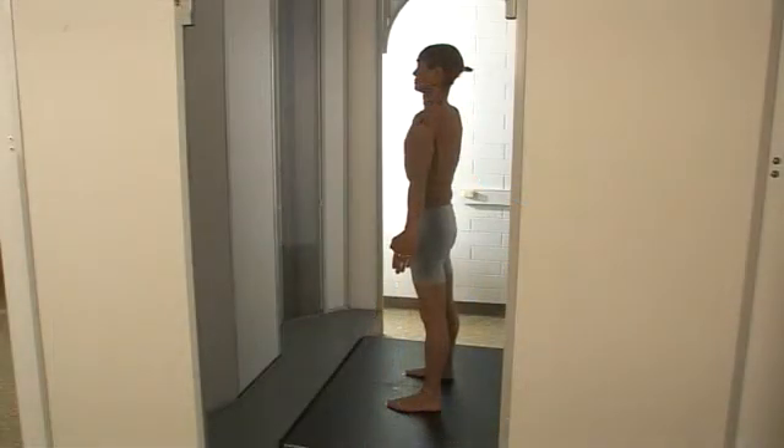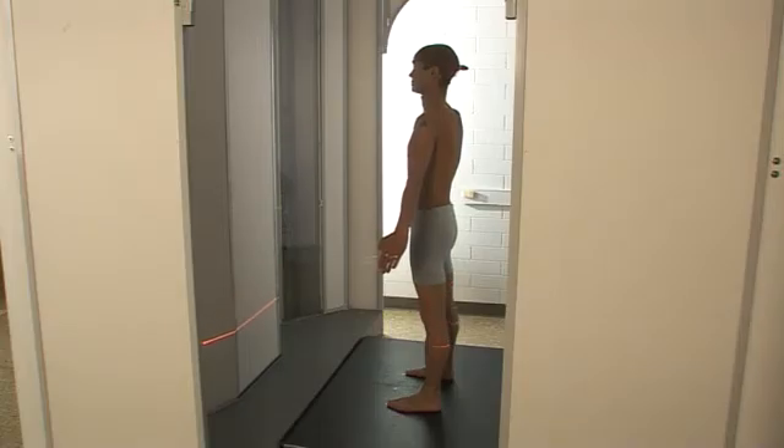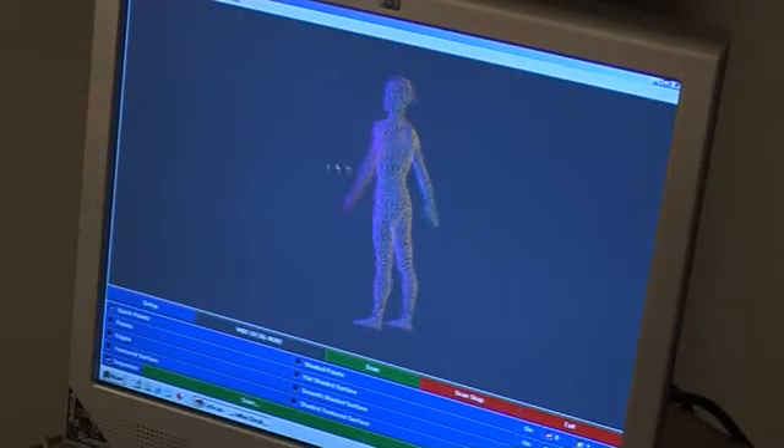A person can stand or sit in the scanner booth, and four cameras mounted on columns move vertically down the four corners of the booth, capturing the reflection of light emitted by the cameras. This way, in a few seconds, you have a visual image of 300,000 3D data points of that person's whole body.